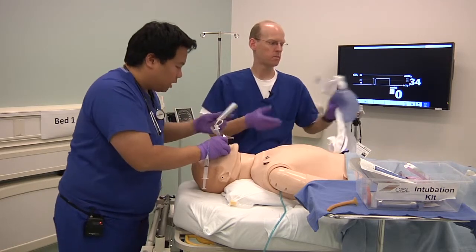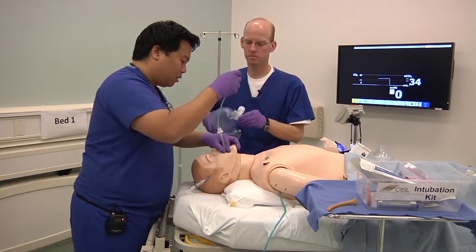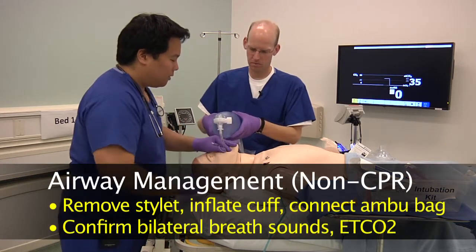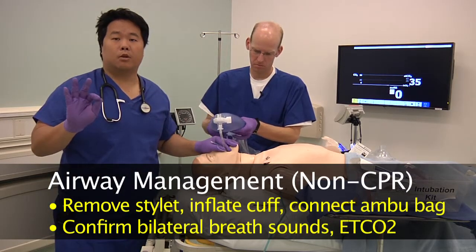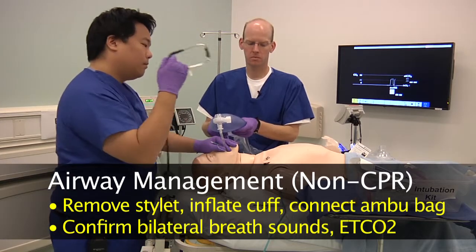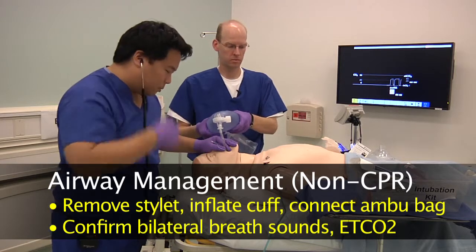And then once that endotracheal tube is in place and the cuff is past the cords, you can now remove the stylet. You can inflate the cuff, and you can have an assistant ventilate the lungs. Now, how do you confirm endotracheal intubation? What you can do is watch for chest rise. You can also auscultate the lungs to confirm bilateral breath sounds.